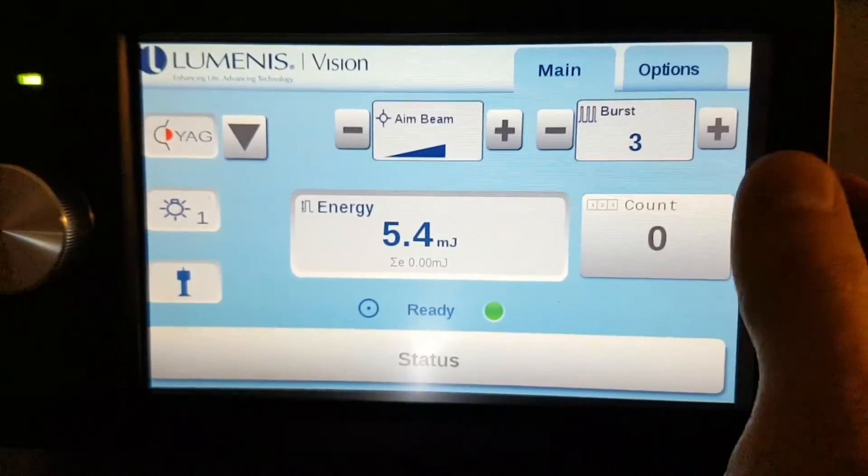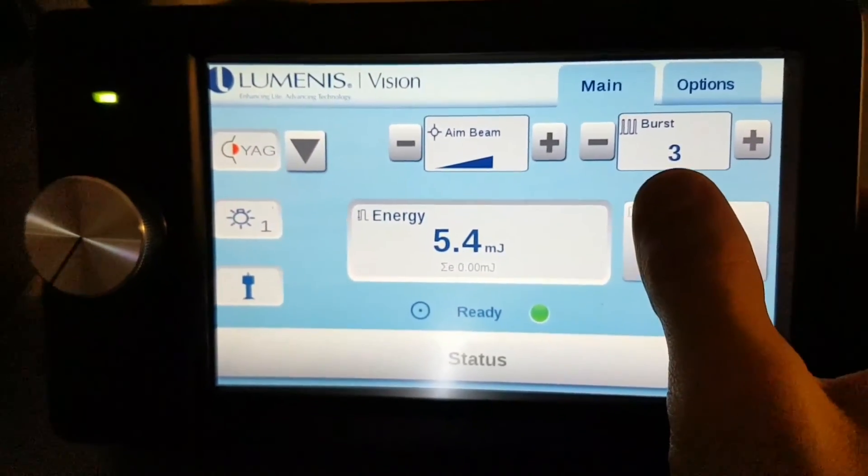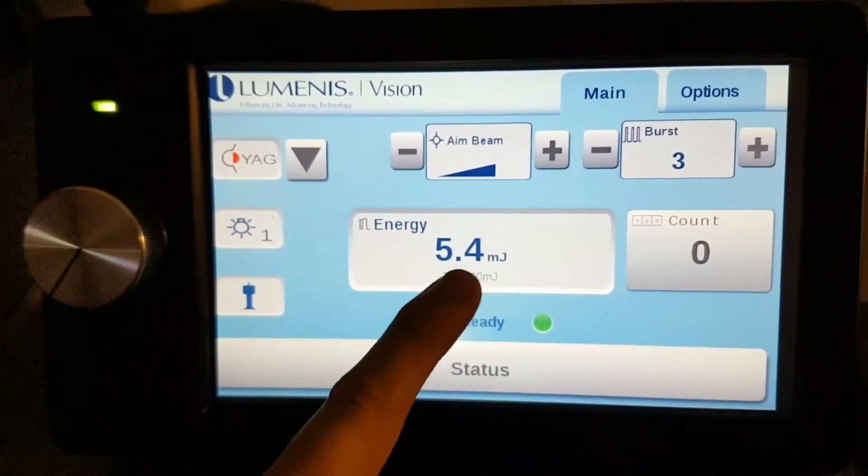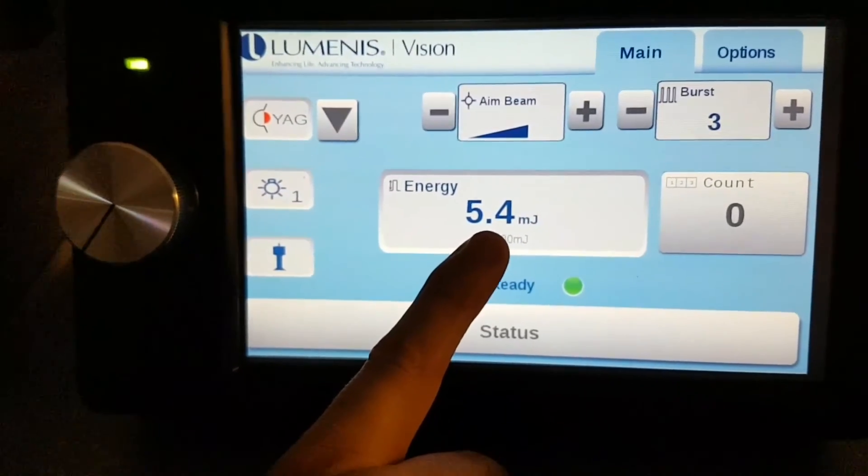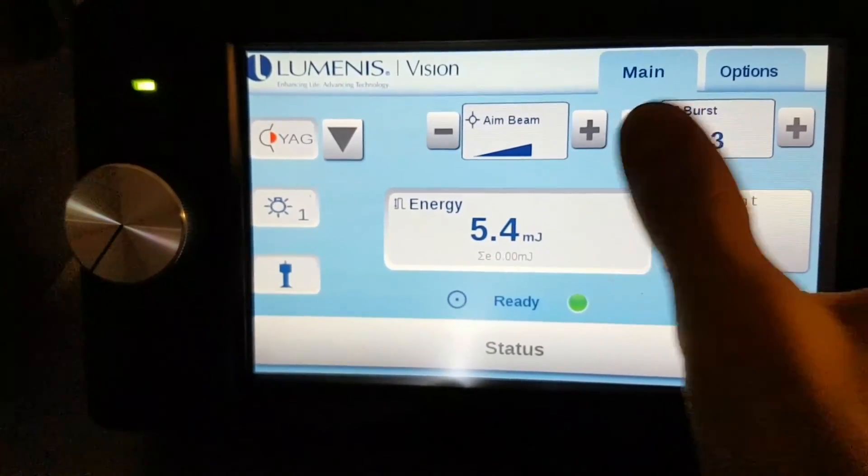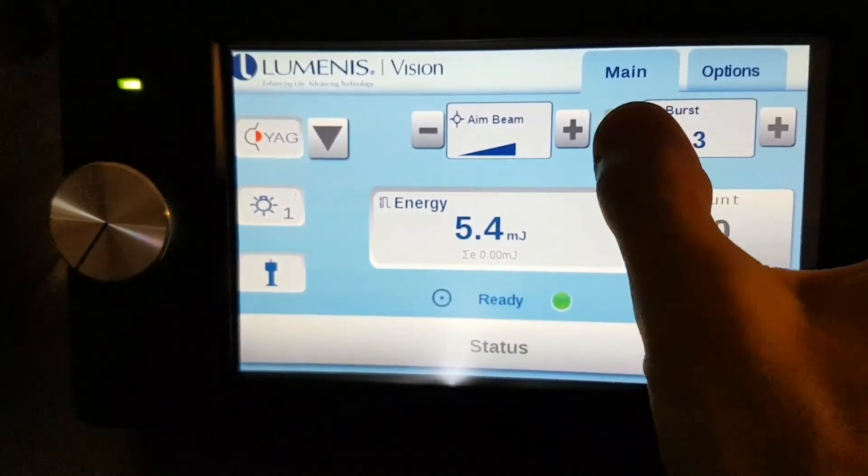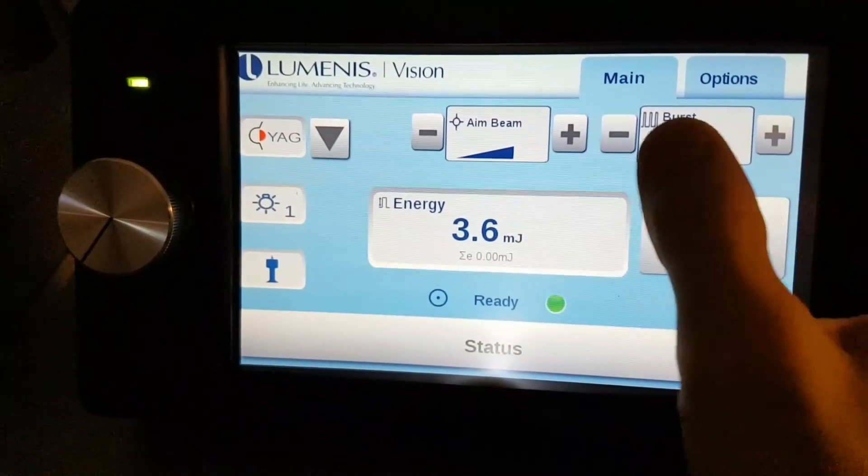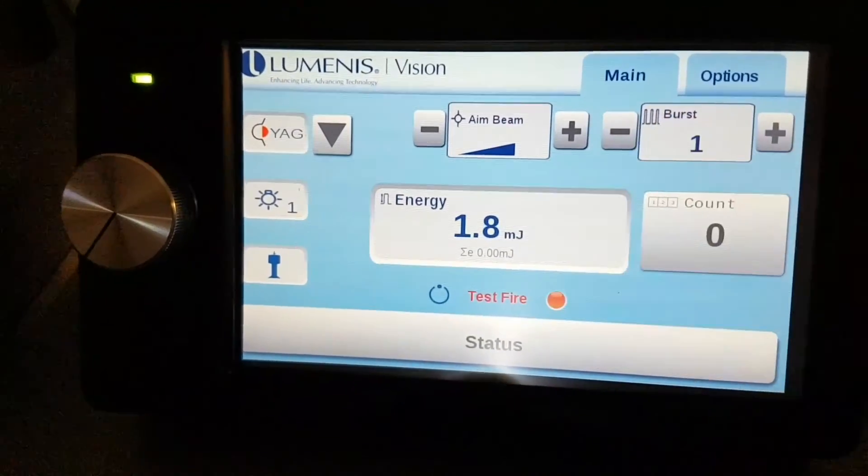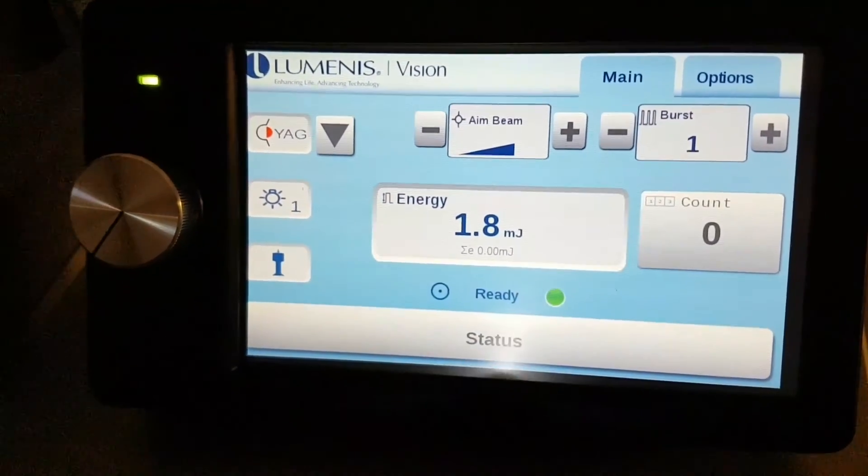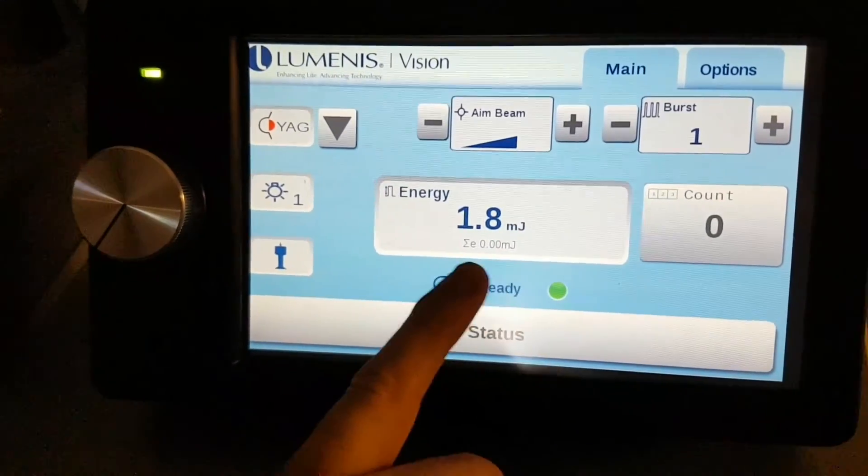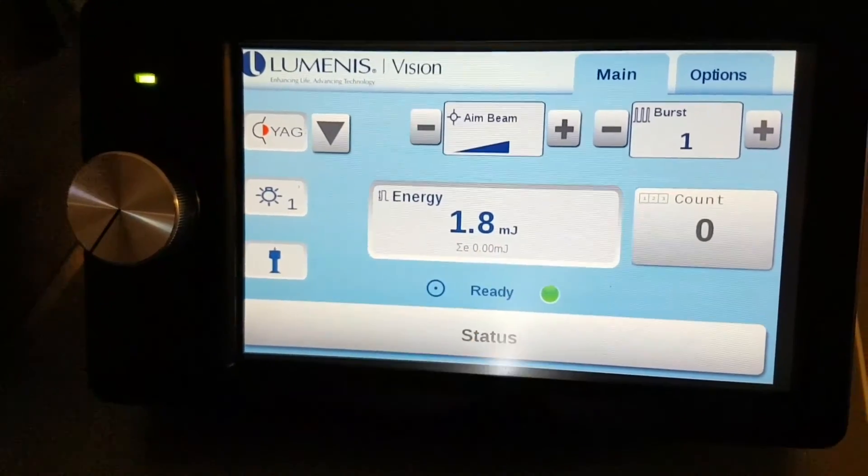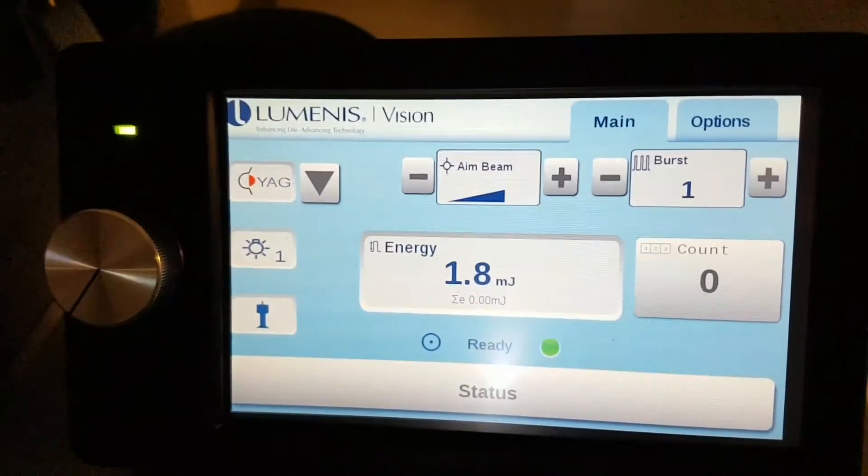In the burst mode, here we have triple shots. The energy is added. So you have three... In this case, you would have three times 1.8. So this is already calculated for you.